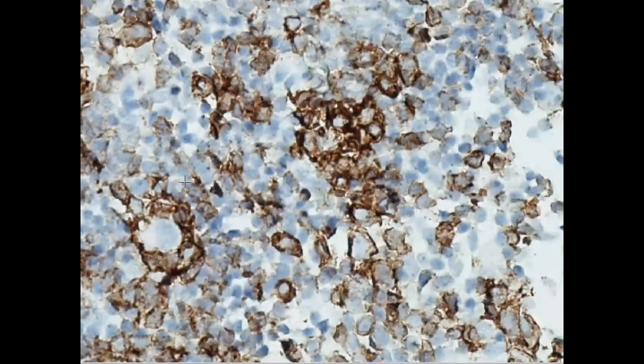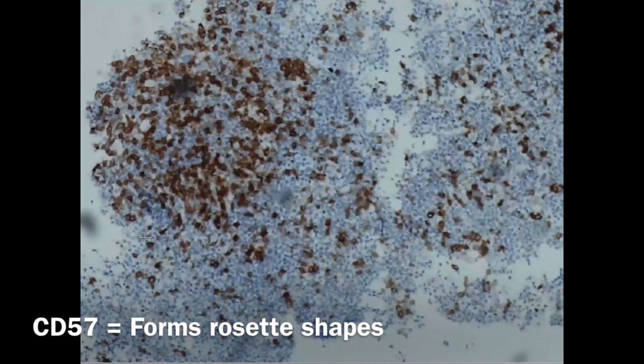Look for this rosette, and look for this rosette also. You can do this with both CD57 and PD1. This is the CD57 and the same rosettes are formed here.